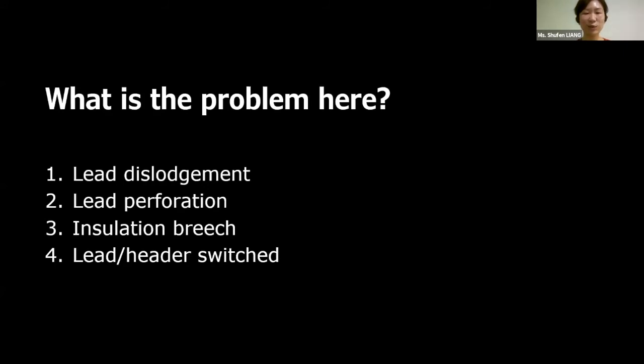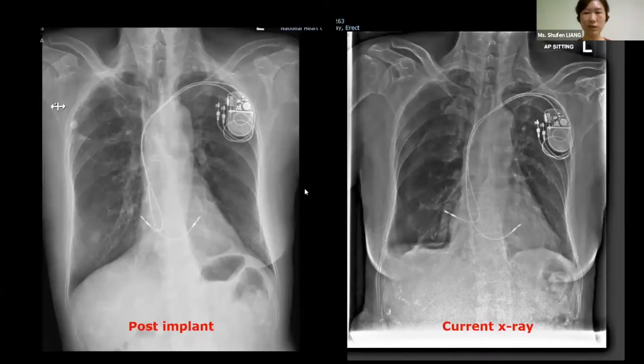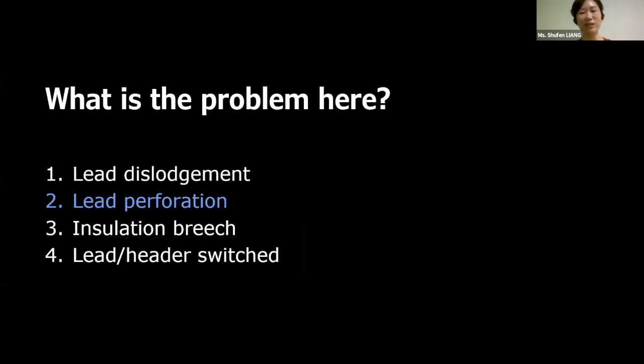So lead dislodgement, lead perforation, insulation breach, or... I'll see if I can show the X-ray again. It is quite obvious on the X-ray, I guess. Okay, wow, so everyone is quite good. It is lead perforation, and in the end, we did go into the OT.